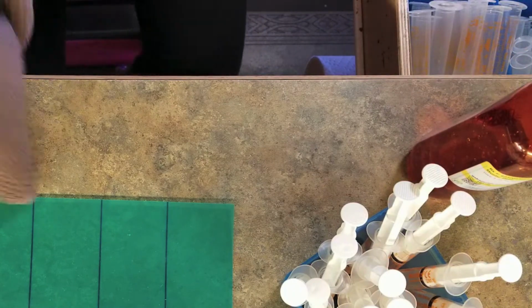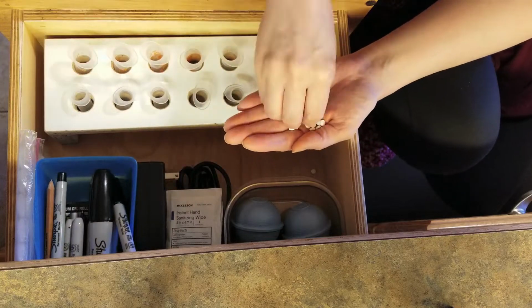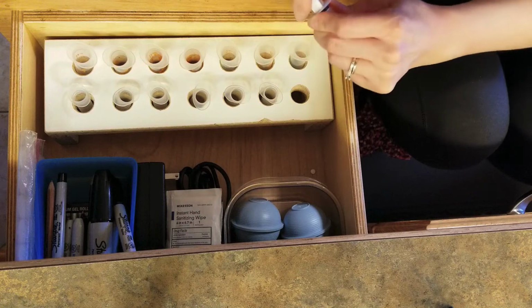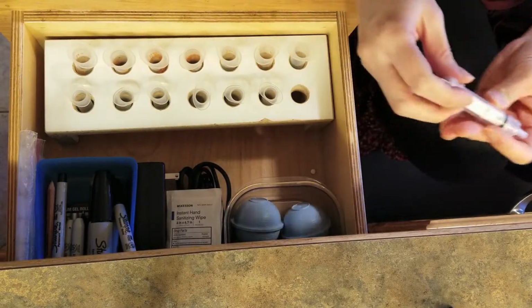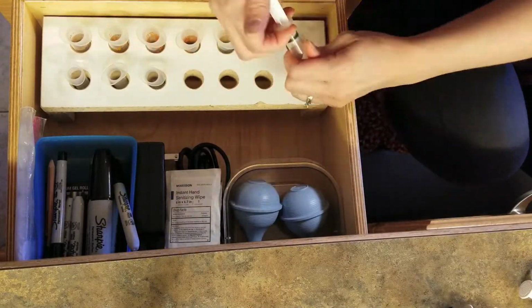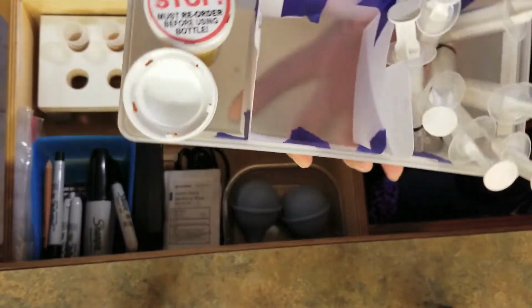So next I'll talk about prepping pill medications. I created this little syringe holder and I just drop the pills into the syringes, and I'm very cautious. I count the pills as I'm dropping them, and I also count the pills again when I put the plunger in. I'm visually checking every single barrel to make sure it has the correct number of pills. I will also double check the dose when I pull the medication from the storage bin before I give it to our son. So all medication gets checked 3 times.